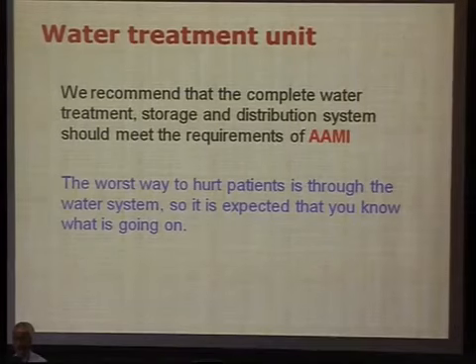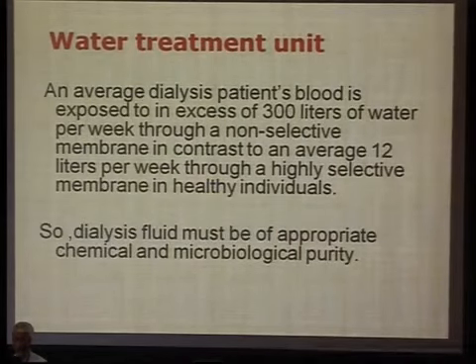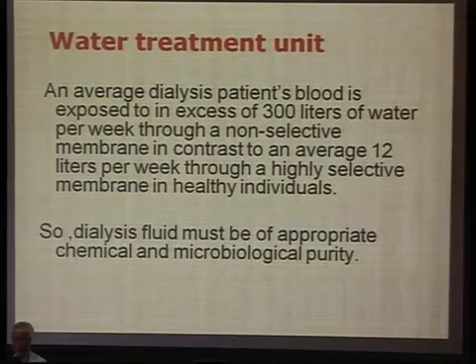Every physician dealing with a hemodialysis unit must be aware of the ideal quality of treated water. He must be aware of the AAMI standards. Because all of us know that the patient on hemodialysis will be exposed during a 4-hour dialysis to 120 liters of water. It's very important, 120 liters. During the week, about 300 liters of water during hemodialysis.